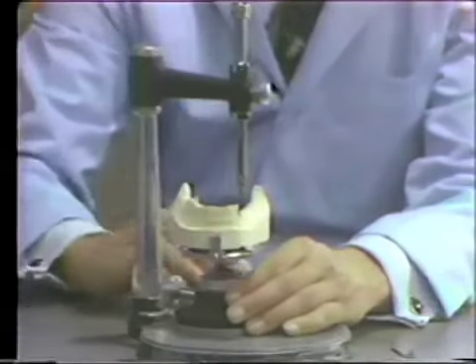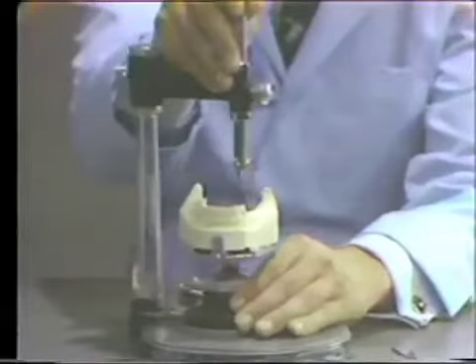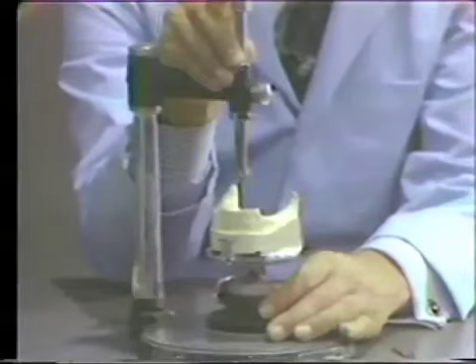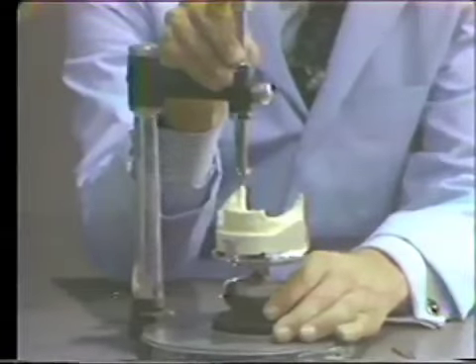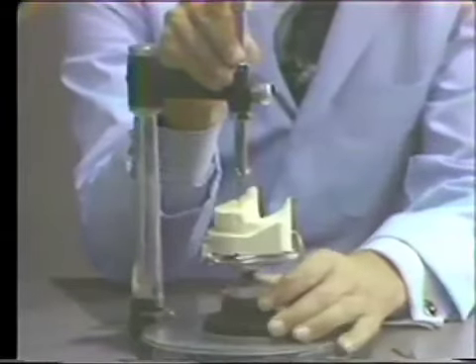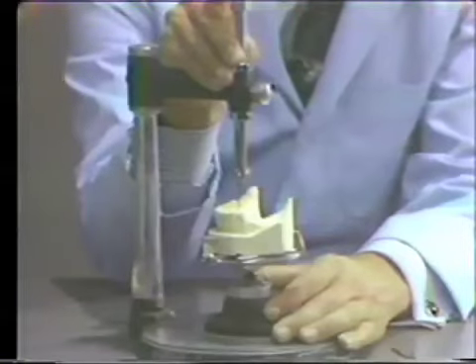So we've looked at the terminal abutment on the bicuspid side just to make sure that we will not have to over-contour anything. Let's look at the molar on the side on which we're thinking we may have to do a full crown restoration. Looking at the lingual aspect of this tooth, we see that we do have an undercut, where we would like to have a parallel surface on the restored crown.